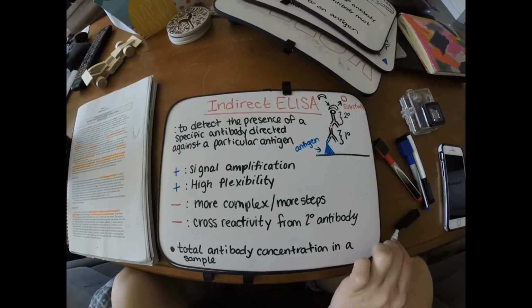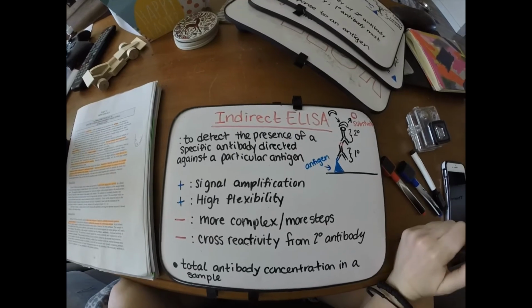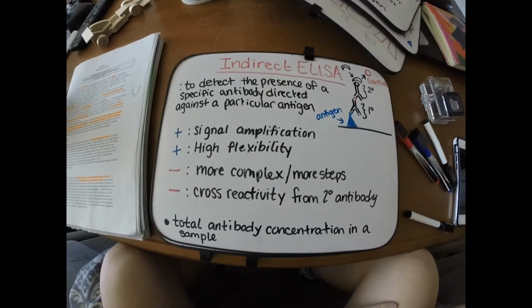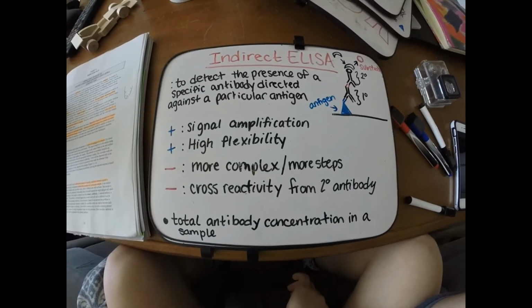But this is something that people would use, like I said, if you were in a hospital and you were trying to measure antibody concentrations in a serum or a sample from a patient. This is what would be used.